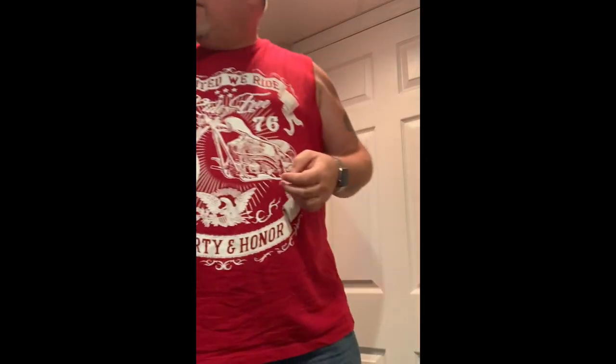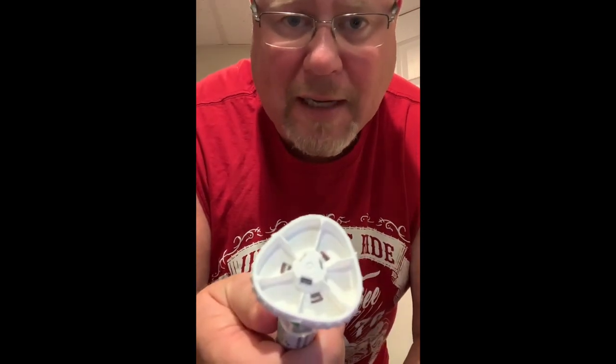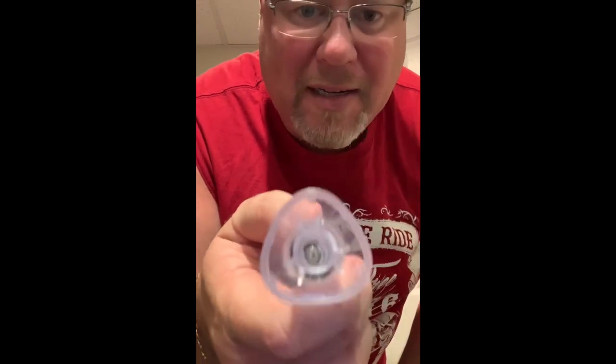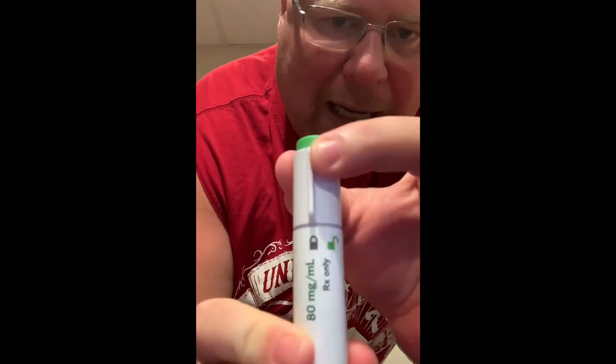I'm not a YouTuber or vlogger — this is not going to be top quality — but here I am to show you how to do a Taltz injection. This is probably like many of the other biologics you're going to be administering yourself. The injector is pretty simple to figure out. All you have to do is take off the safety cover by twisting it — and voila. The needle is now exposed inside the injector. Step two: the button on top is locked, and you need to turn it to the unlock position. There are two positions — locked and unlocked.